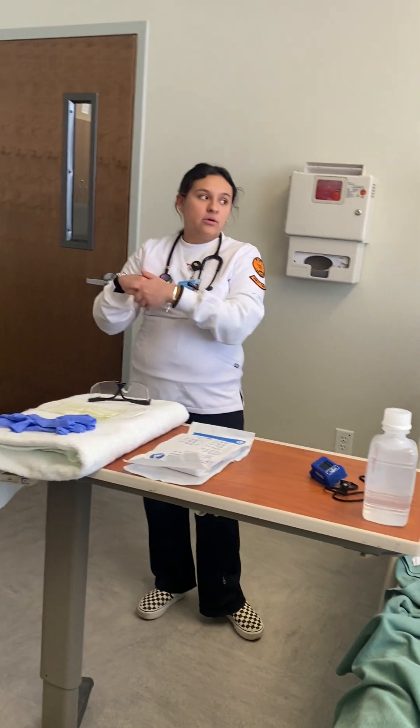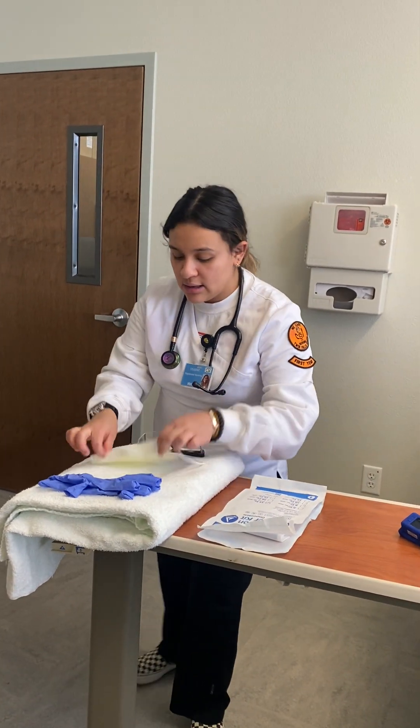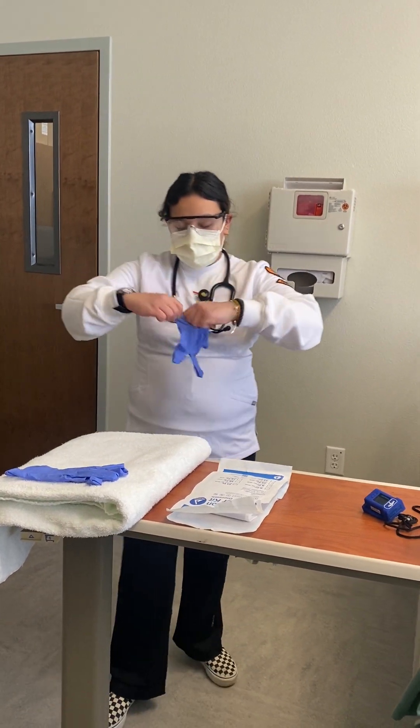I'm going to go ahead and wash my hands and then I'm going to put on my PPE — my mask, my goggles, and my gloves.